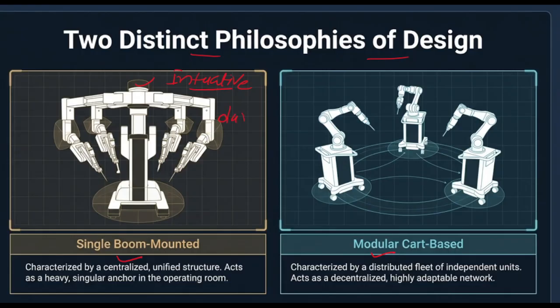Their robot is the Da Vinci Robotic Surgical System. It may be Da Vinci Xi, which started from the Si, and currently the market has the DV5. Da Vinci 5 is not launched in India yet, but the Xi is there.